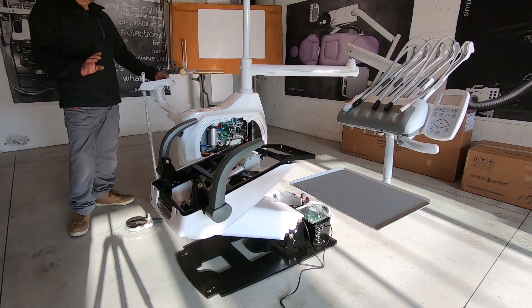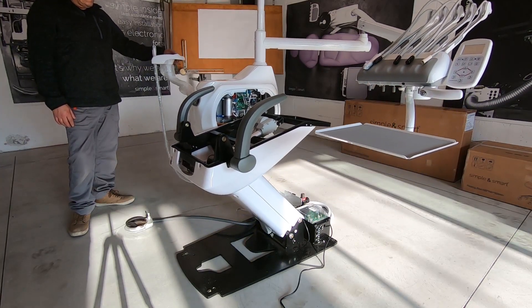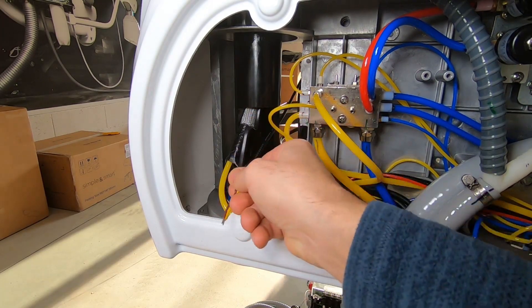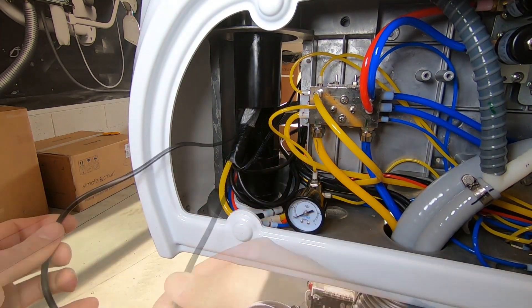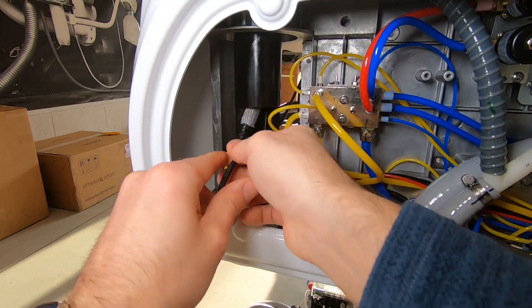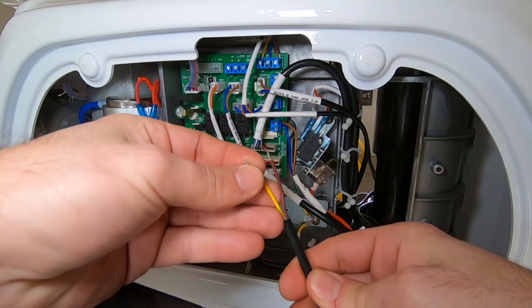Raise again the seat. Bring the cable up to the other side of the water unit and connect the wires to the lamp connector.